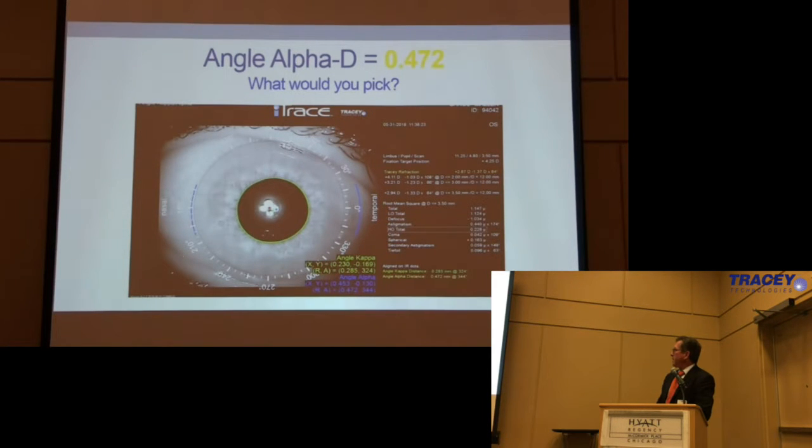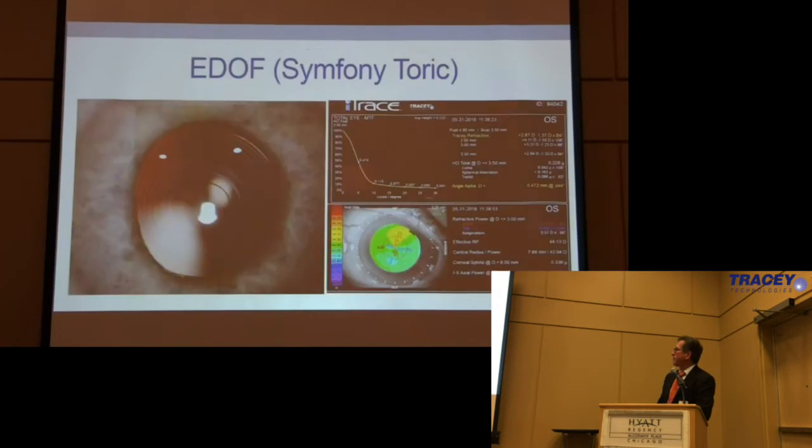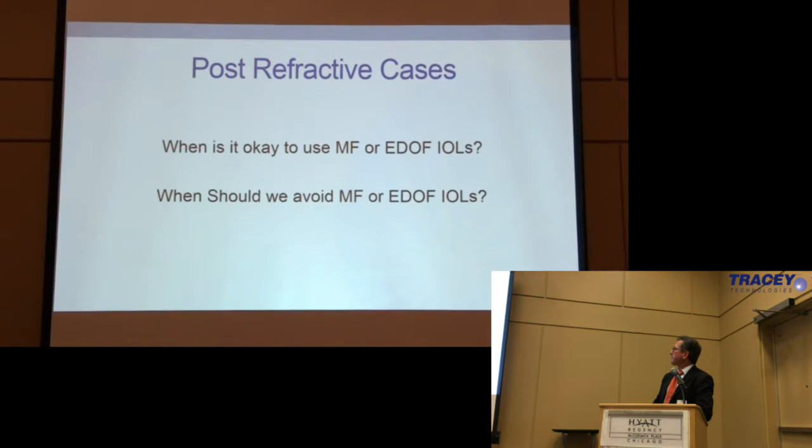So I'm a little hesitant about a true multifocal, because she's right at that edge, she might wind up in an echelette on a true multifocal. So I went ahead and put a Symphony toric in this eye. And I don't have a problem mixing and matching, especially for the non-dominant eye. This lens works actually very well, and the patients don't really differentiate too much. And she wound up being a 20/20 J3 by doing that.